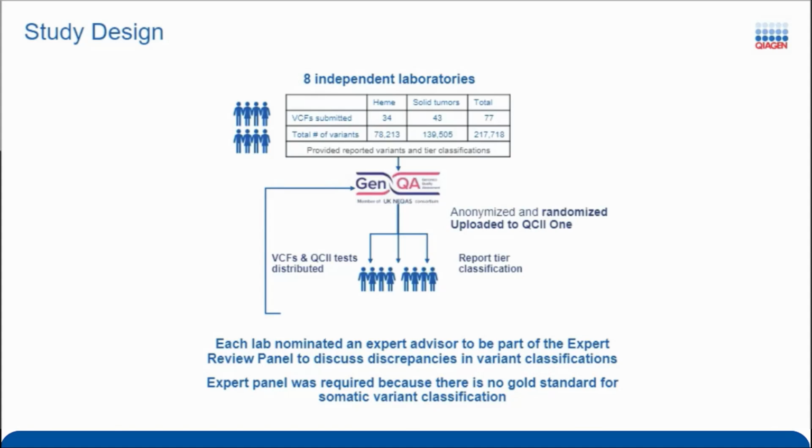So we set the cutoff at 10% for those particular VCFs. That discordance would have all disappeared, and we assigned that as a technical issue as opposed to a discordance. So I think that's quite a good example of what Jim's been talking about: individual cutoffs need to be applied to different samples.